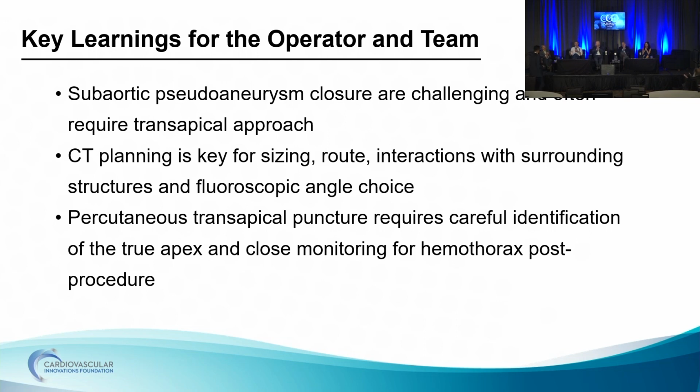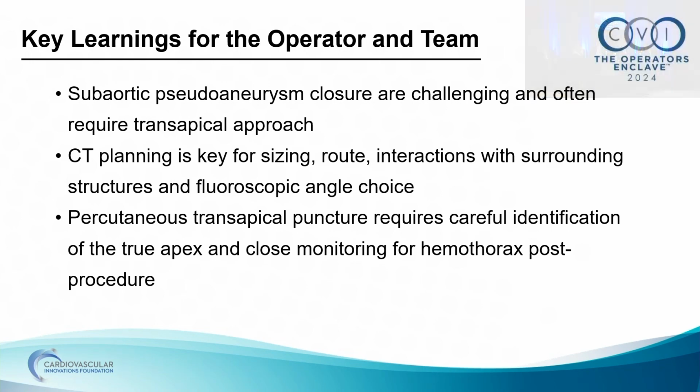Yeah, that's great. I think it's interesting, the defect, when you actually got in, it seemed like the neck was much smaller than you'd measured. But I guess these are very dynamic, right? They can really move with the myocardium. So maybe the CT was gated to end diastole or systole, or I don't know what phase it was, but that was probably the worst case scenario. Yeah, absolutely. Whenever we're sizing on CT, we're probably going to look at the biggest diameter, so it likely is going to be towards end systole, where it's going to be the largest.